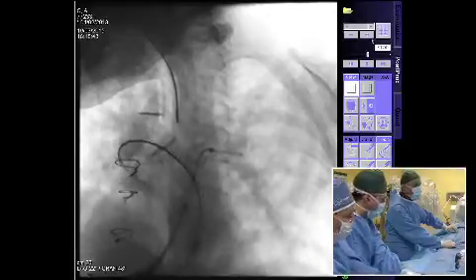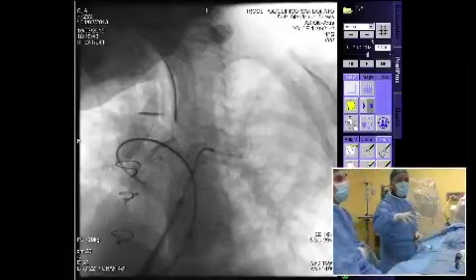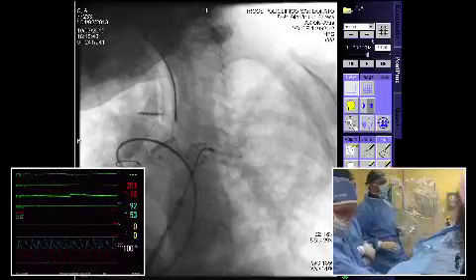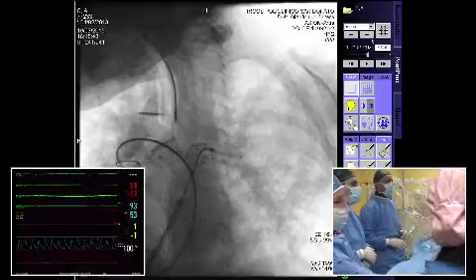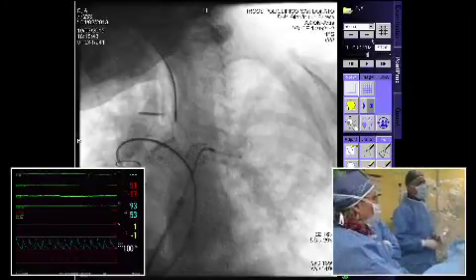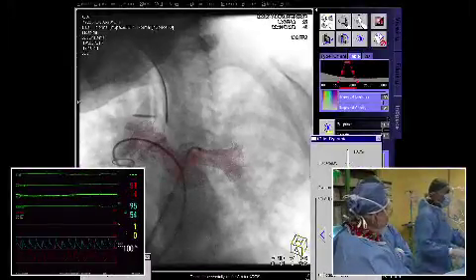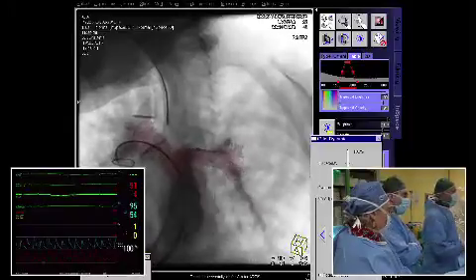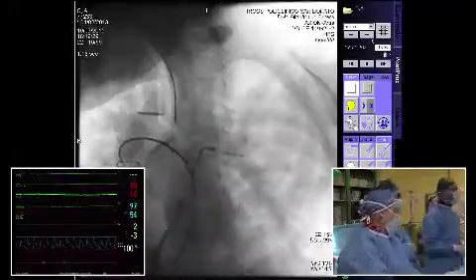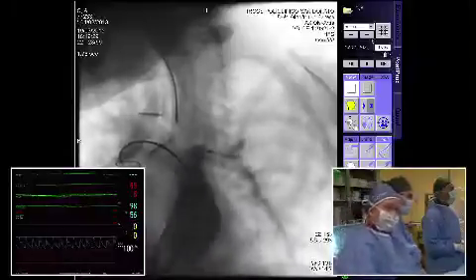So we have removed the balloon now. Please give a look at the pressures here and perform a good angio, please. 12 to 10, and we show you that, and we have finished it, Philip. Just show us the retrieval of the balloon, and then we move. Okay, have you seen, 95, 93, 95 over 50, and we may go for the angiography. Please go for the angiography, and you see the final result. Gianfranco, congratulations, because without retrieving completely the balloon, the hemodynamic result is fantastic.